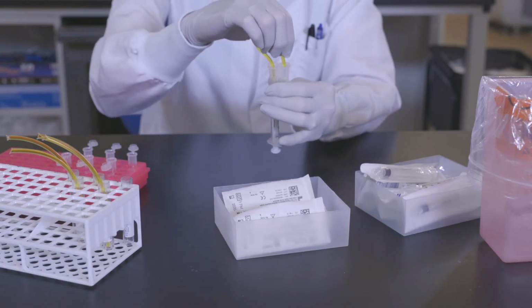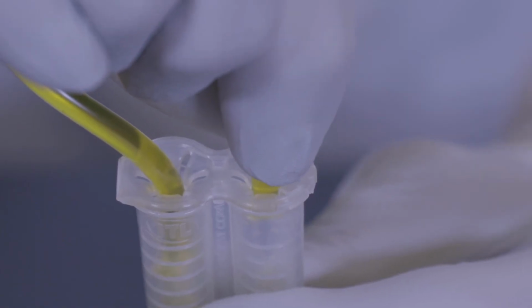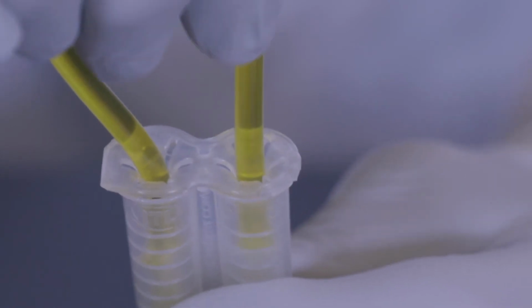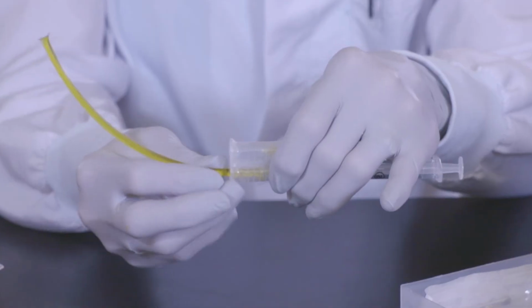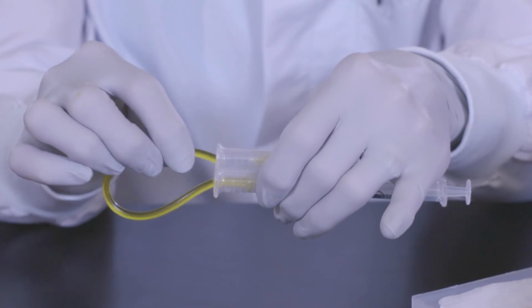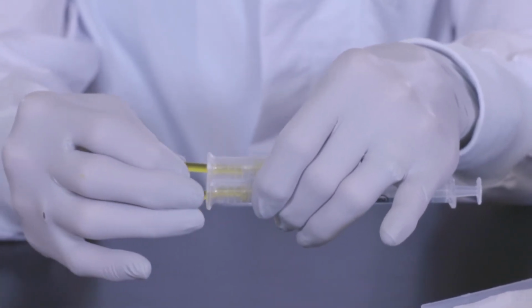Insert the other end of the segment into the other segment sampler opening. Make sure to guide the segment end straight down and into the segment sampler opening. This helps to ensure that the tubing segment is pierced by the internal needle. You may find it helpful to hold the segment sampler horizontally to observe the piercing of the segment end.